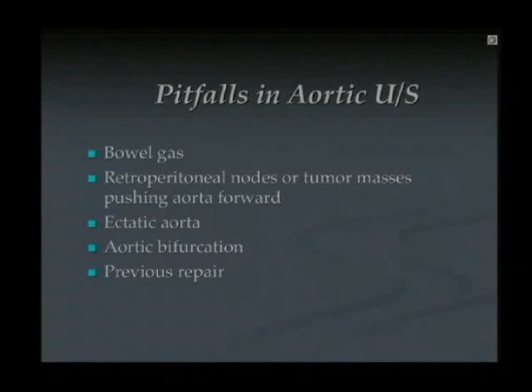That whole aorta needs to be imaged, not just a couple of centimeters, the whole thing, because otherwise you could miss a focal bulge. And if they've had previous repair of the aorta, either with a stent or with an operative repair, all bets are off. Okay? Get a formal study. That's not our territory at all. Stay away from that aorta. Call other people to help you. Any questions on aorta?